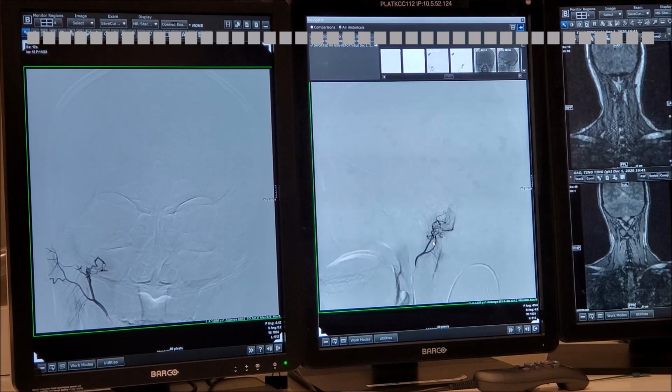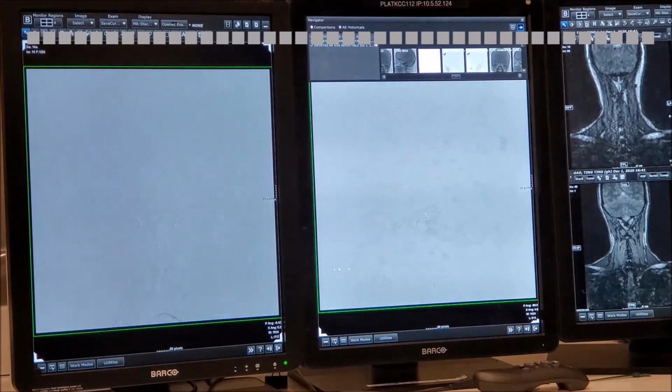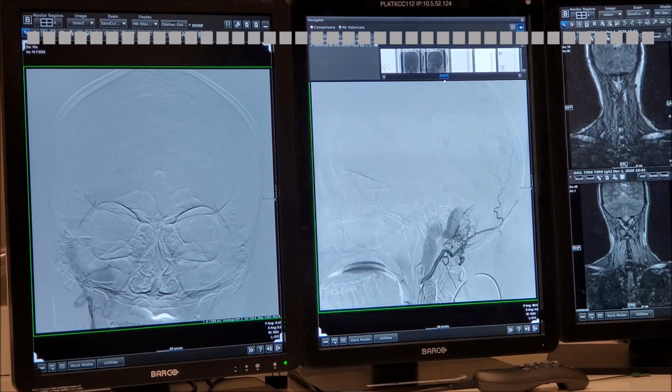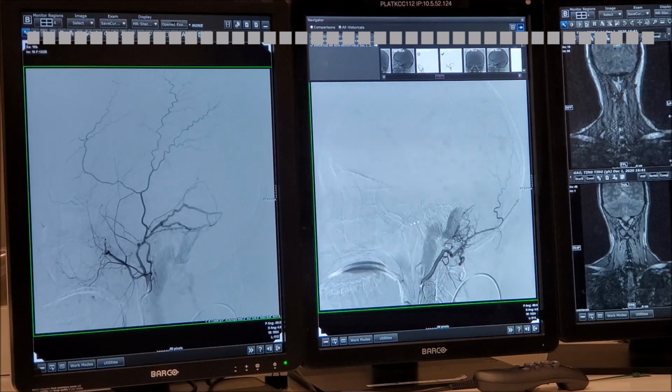And that's a stylomastoid? So that prominent medial branch is a stylomastoid, right? No, it's a bad branch, in the lower part. It's in this part. It's a cutaneous branch. It is posterior auricular. So let's see what we do next. Which one is this? Occipital. Correct.